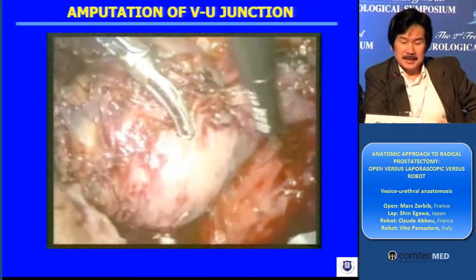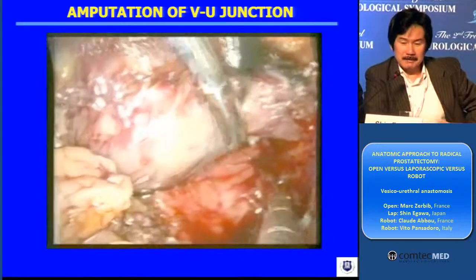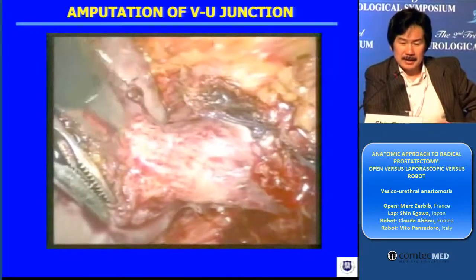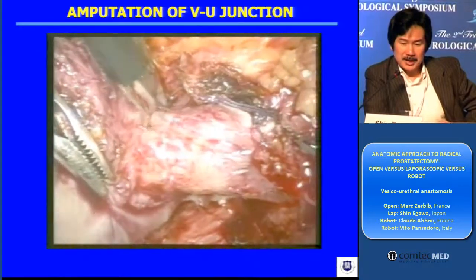So the result is here. You will see a much more beautiful view of the junction. And I'm amputating the junction right on.